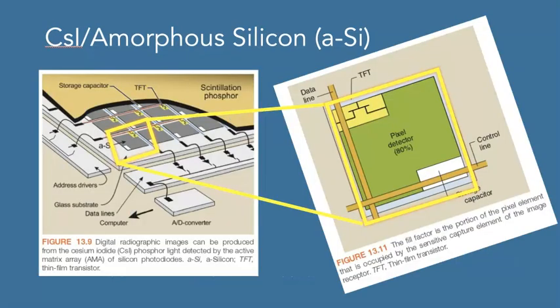Going too far into these different elements is beyond our scope of practice, so we just go into the basics. So let's take a look at this schematic here involving cesium iodide and amorphous silicon. Now, these components are basically all compiled or organized almost in the way pixels are. So they're each kind of tiled together like we saw in that previous indirect method. So let's take one of these out.